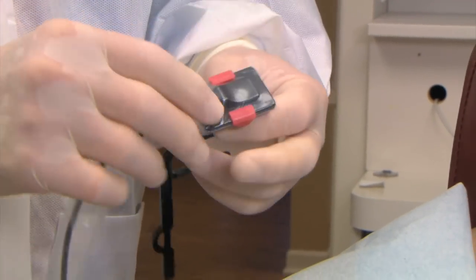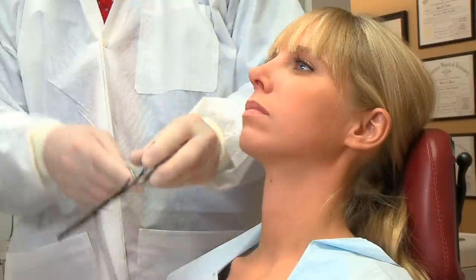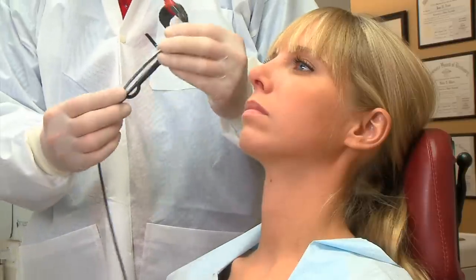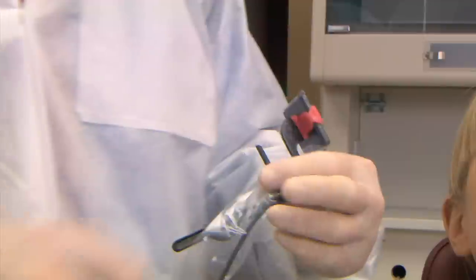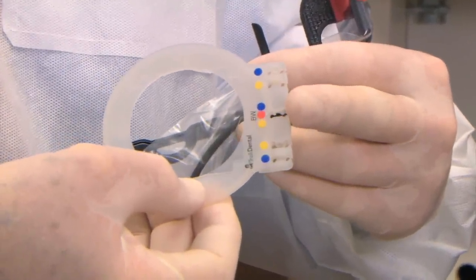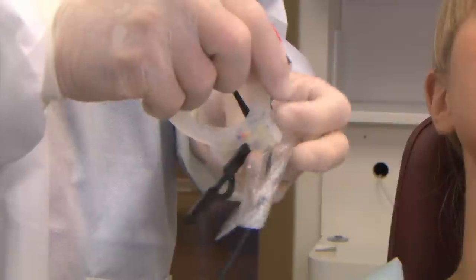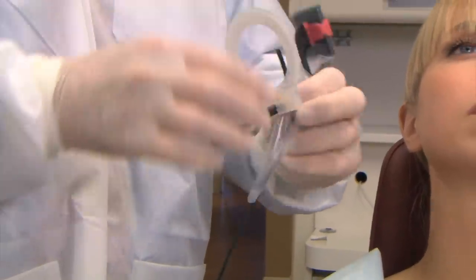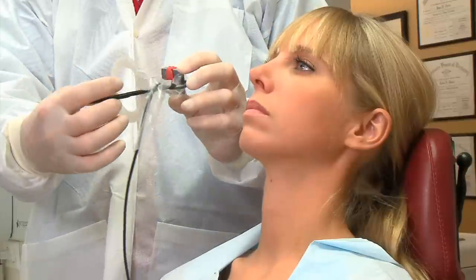Push the sensor in halfway for bite wing position. Keep the cable along the arm of the holder. The aiming ring is color-coded, with dots indicating the location for each holder and image position. The red dot is for the bite wing position. Slide it on until it snaps into place — you can move the ring along the arm, and we recommend moving it as close as possible to the sensor.